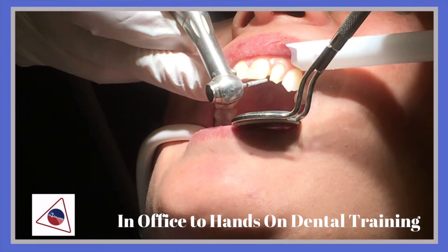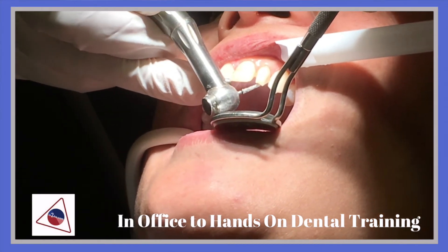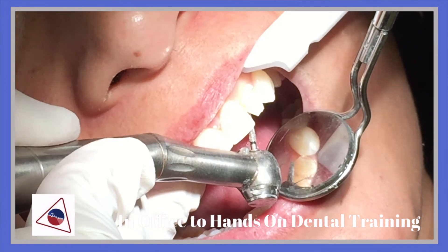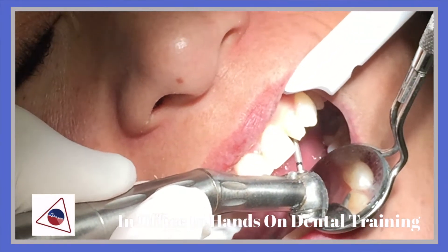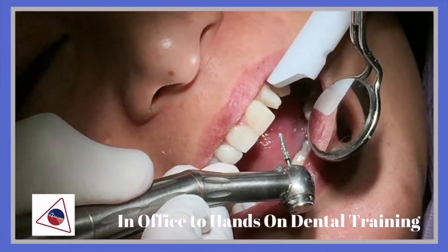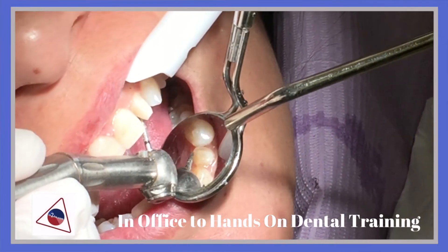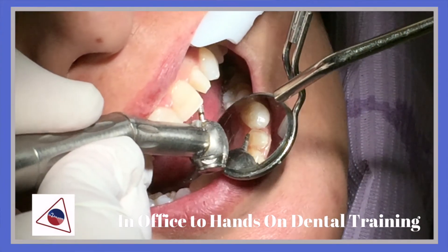I'm going to go ahead and put the margin on the lingual side of tooth number 10. I'm going to put the margin following the CEJ. I could put the margin just right above the gum line.